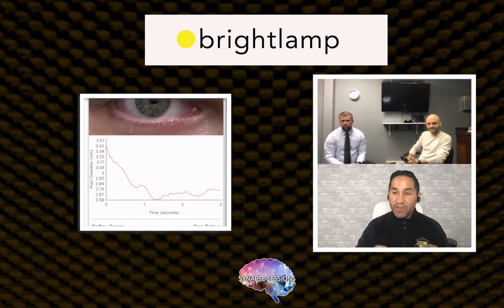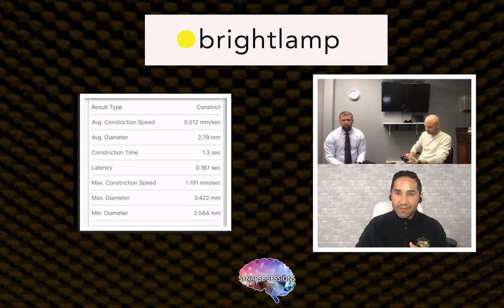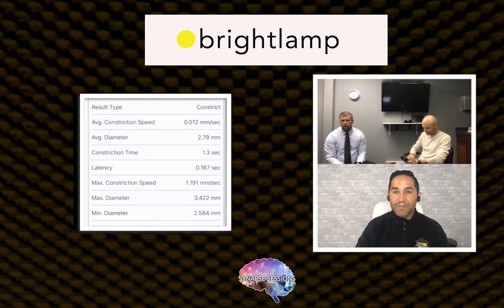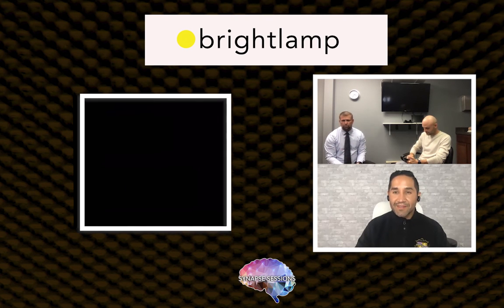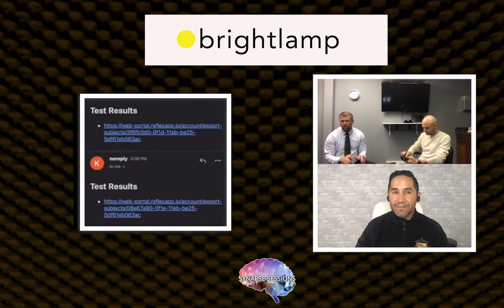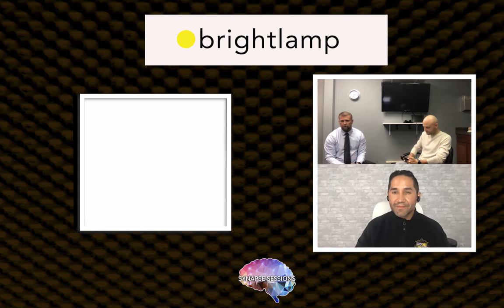So the app does give you some sort of norms to compare your individual patient to? Yes, there's some published concussion norms that we go by. But it beautifully shows you what's abnormal and what's out of range. So like at the bedside, if I'm working with a kid and he's had a recent event, I kind of know that he's had an event that's significant if his PLR falls out of range.